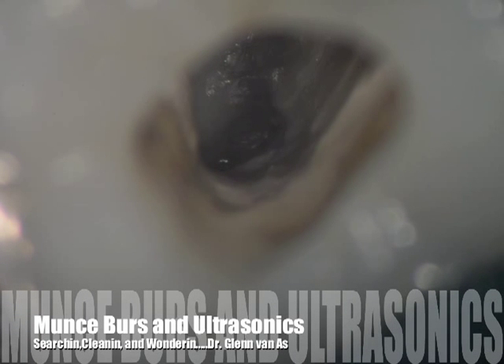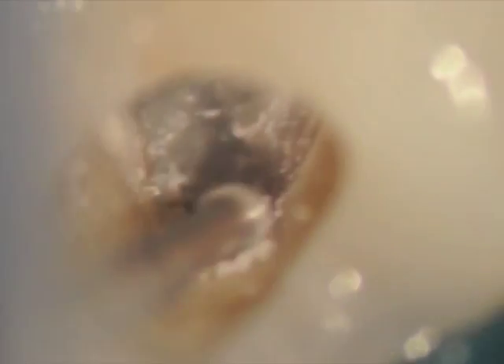What you're going to see in this video is a combination of using Munce Burs and ultrasonics to try and uncover hidden anatomy. In the beginning we're using a medium sized Munce Bur — these are 31-34mm in length and they're slow speed. You can see the round burr here used to trough both mesially and apically to try and uncover the tissue. It shows up as little white lines. These are quicker than ultrasonics for removing dentin and they can be selectively used in very small sizes.